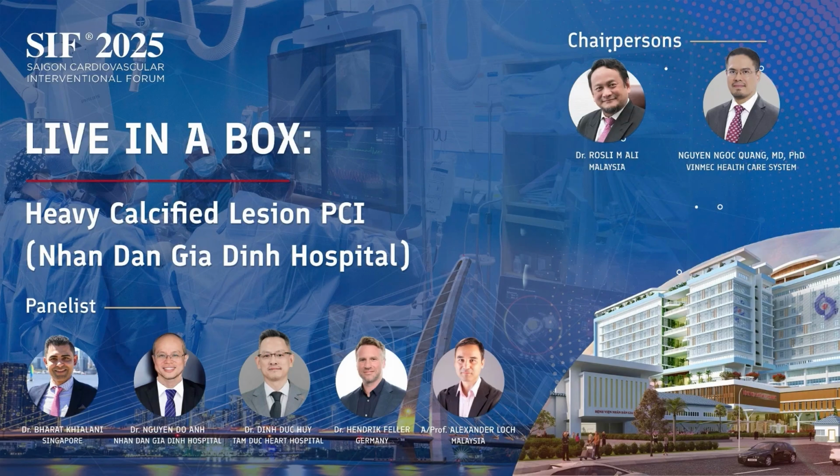Dr. Takashi, do you have any comment or suggestion after you see the whole case? Okay, I have a question for you. In Japan, some people say that we need volume reduction for calcified regions. The goal of calcified region treatment is to get a good MSA and circular stent expansion.